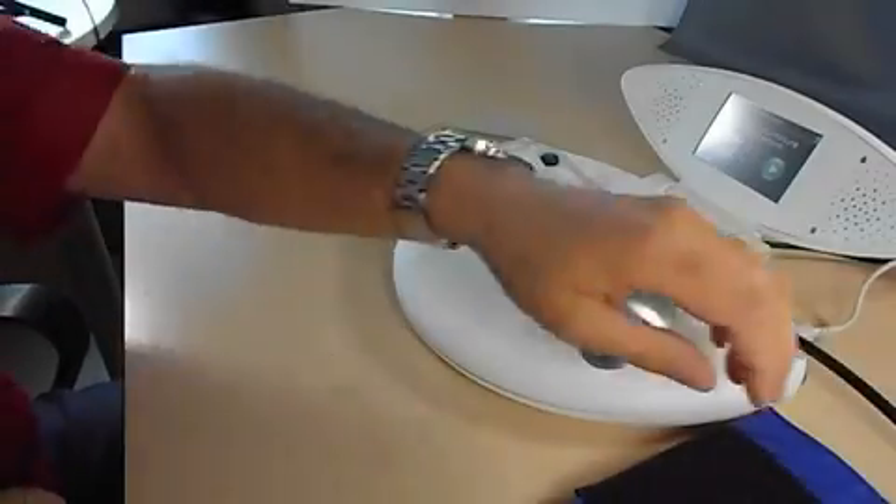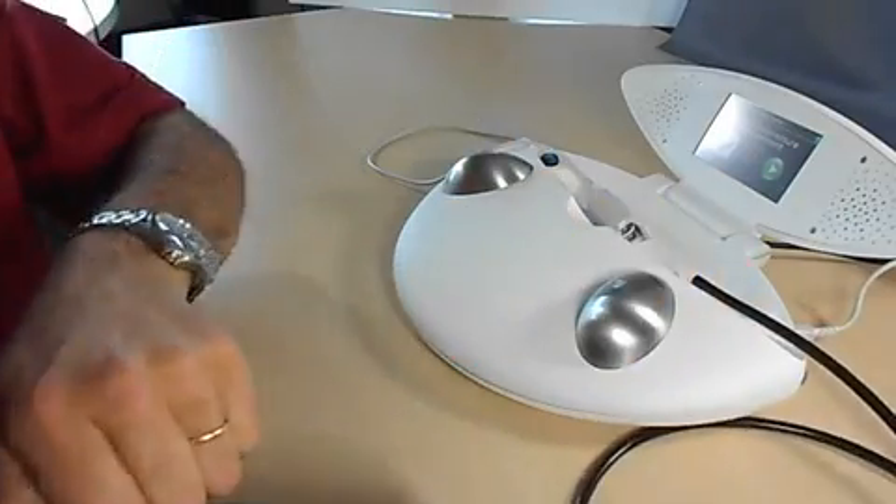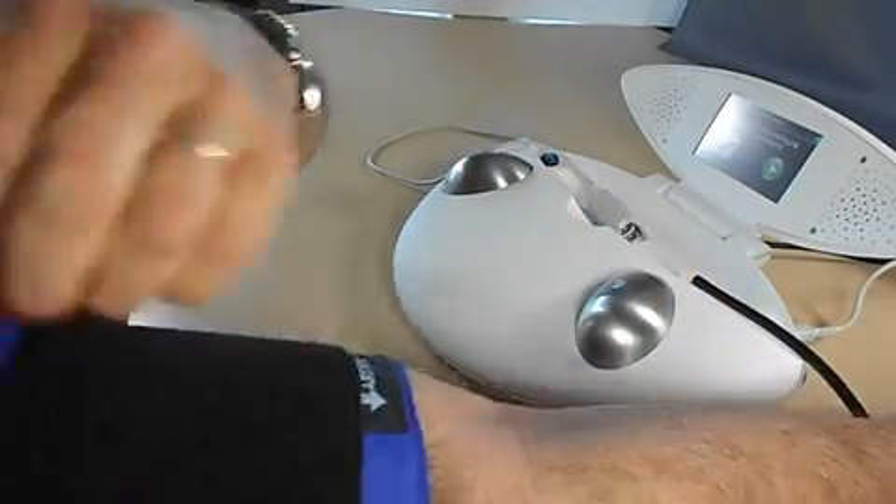Place the blood pressure arm cuff on your right arm and push the green start button on the screen.